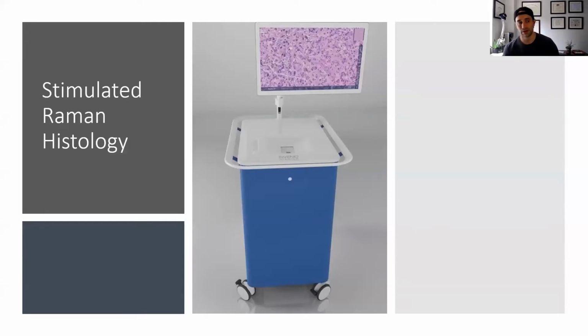This is something called Raman Spectroscopy. Traditionally, what we do is we take a tumor out, we send it to pathology, and they do something called a frozen section analysis. Frozen section analysis takes about 20 minutes. They freeze your tissue, they run an H&E stain, and they look at it under a microscope. And then the pathologist has to interpret it and send it back to you.